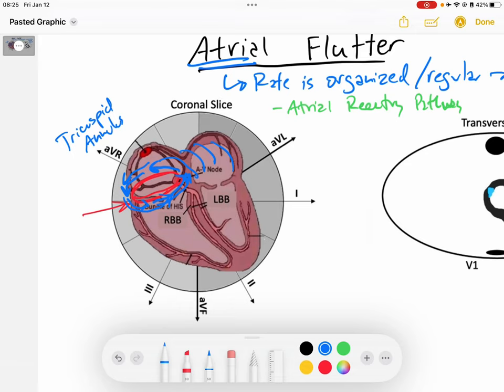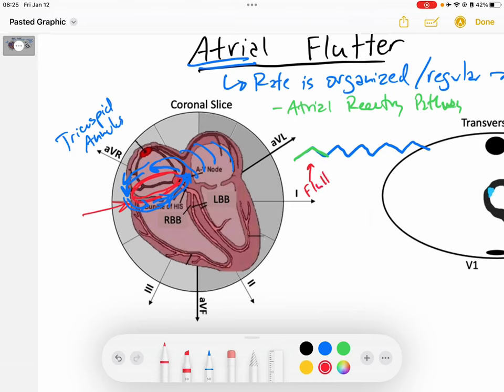This reentry circuit creates the sawtooth pattern that we commonly associate with atrial flutter. Each of these sawtooth deflections represents a flutter wave. The rate of these flutter waves — from flutter wave to flutter wave — is roughly 300 beats per minute, representing the wave of depolarization occurring every time it re-enters this circuit in the atria.